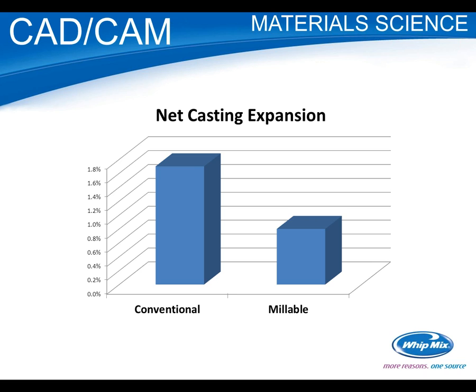Now, I've talked to a number of lab people that are using CAD/CAM, and they've never noticed a difference. But for us, under our controlled environment, we could see that. So what we would do, if we wanted to compensate, is increase the liquid concentration.